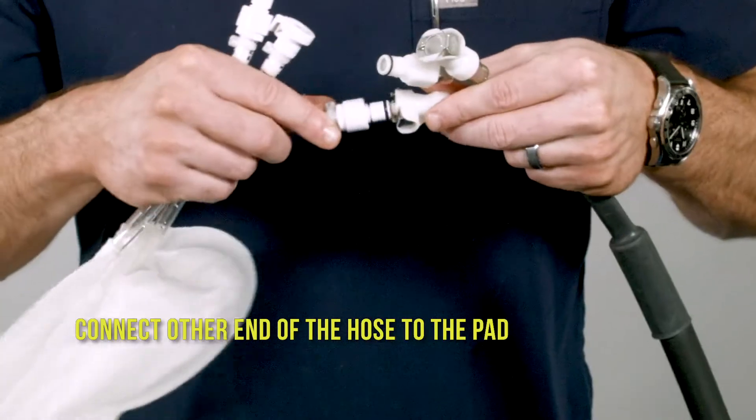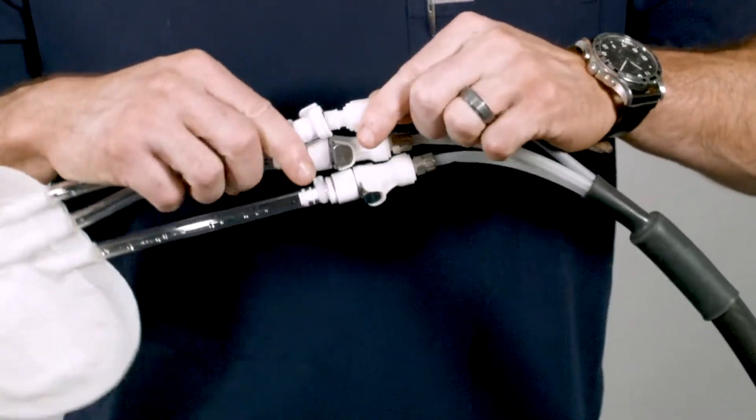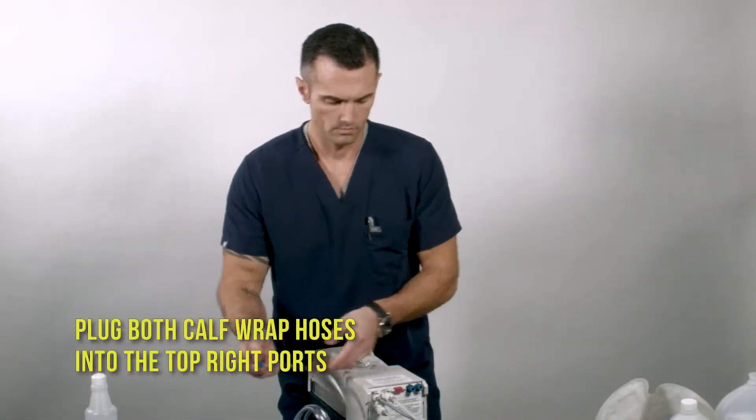Connect the other ends of the hose to the pad. Plug both calf wrap hoses into the top right ports.